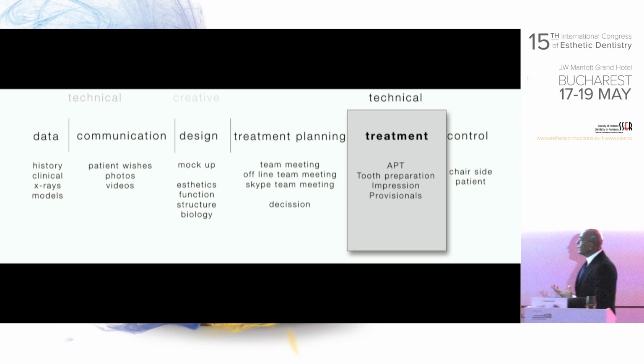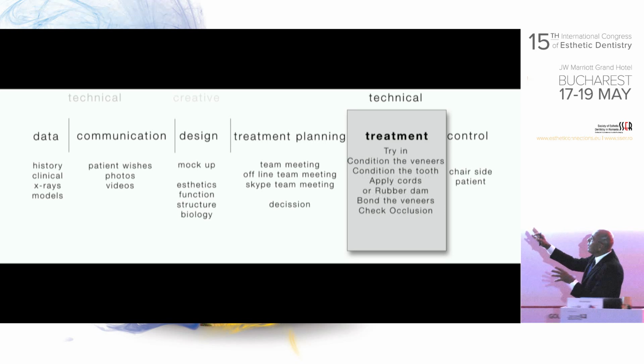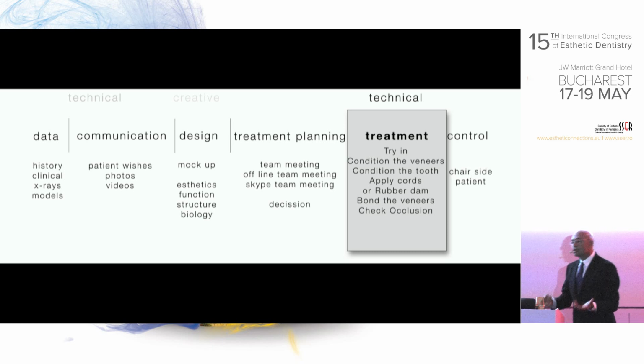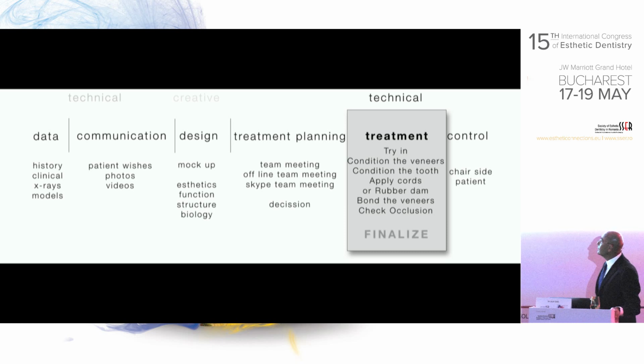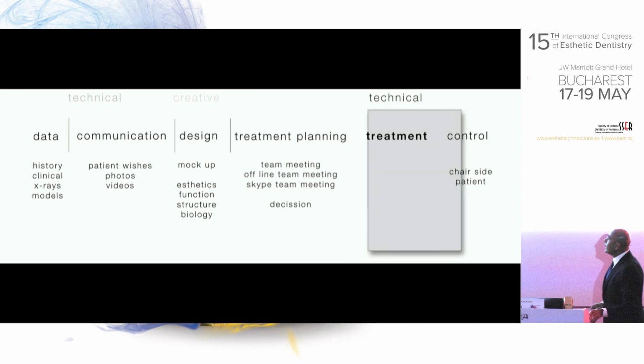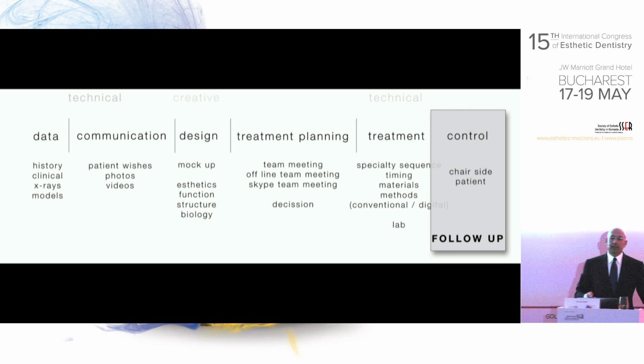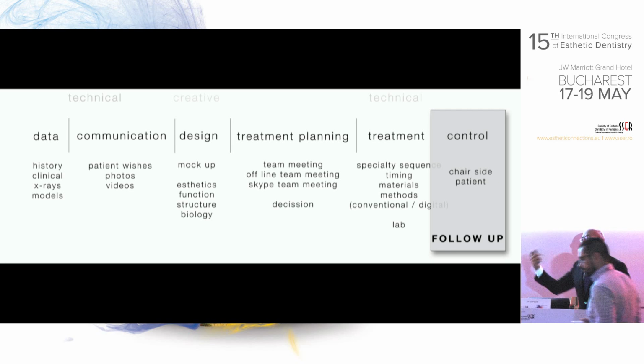Once the case is accepted, we go through the APT, tooth preparation, impressions. Again, all these columns are technical parts. You can even watch YouTube and have tons of information on that. And of course, when we finalize the case, it's the control side for the patient, both in office and after the treatment.